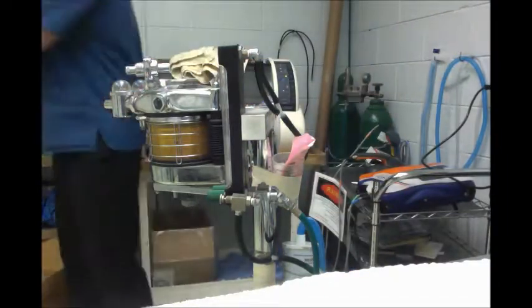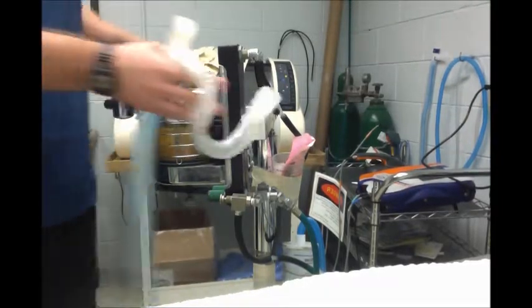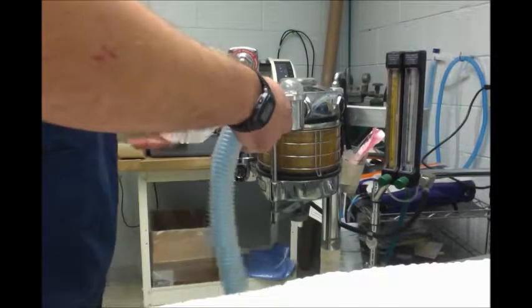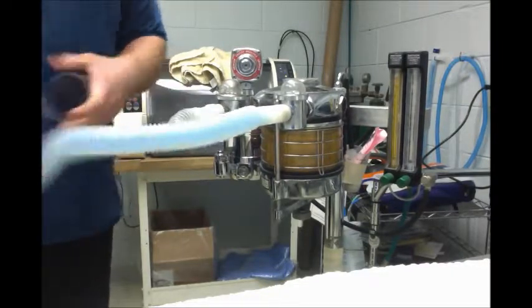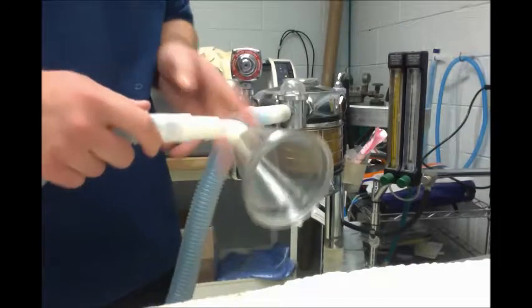Take that straight off. This is the rebreathing system. Hook it straight into there. And we can hook up a mask to it. So this is one way to knock out a patient.